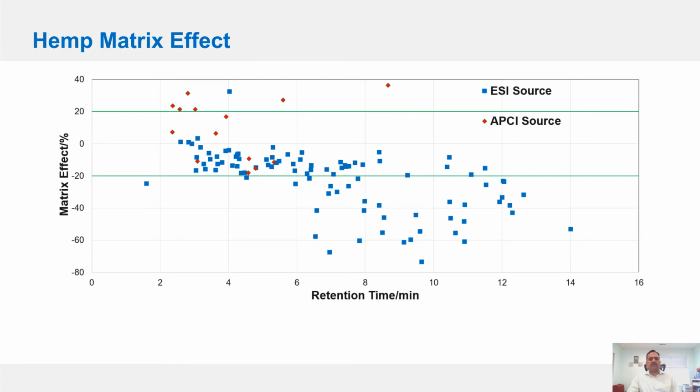These 30 internal standards are part of the PerkinElmer pesticide reagent kit, which also contains certified pesticide and mycotoxin CRMs and consumable items to prepare your samples. At this point, I would like to define the accuracy, which is taking the ratio of the measured concentration and your spike concentration.